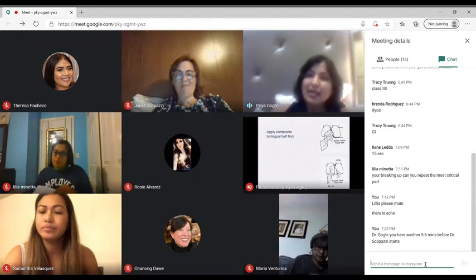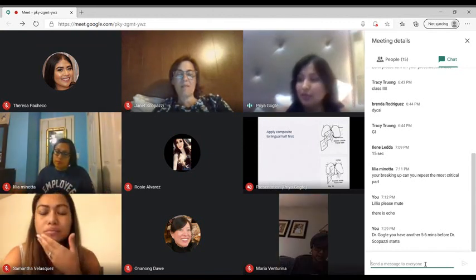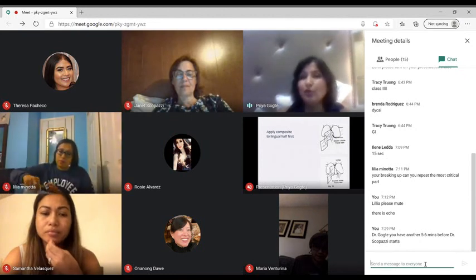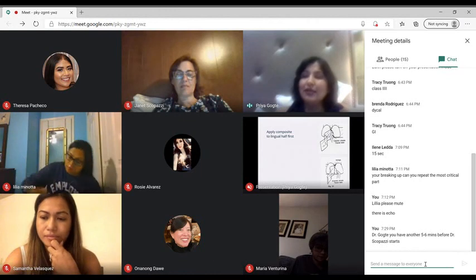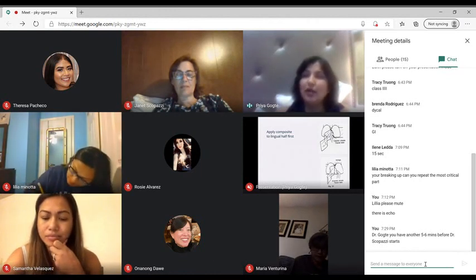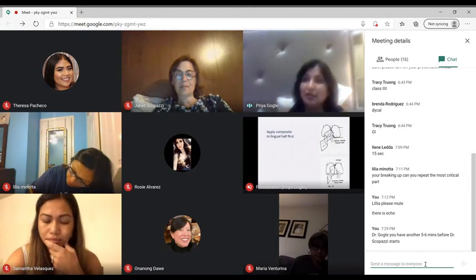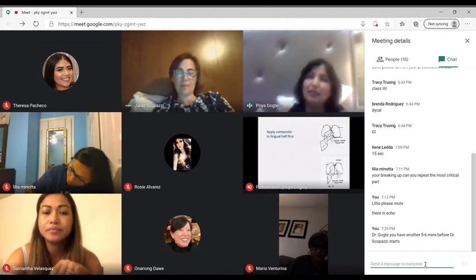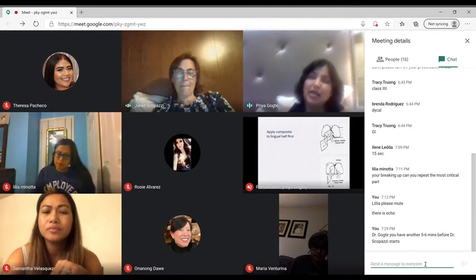And then at the incisal edge, if you want, you can put the translucent shade again. Just don't put too much translucent because translucent shades start giving a little gray look. The best is that the regular dentine shades are very forgiving and they're opaque, so they work pretty well. If you are in doubt, just use that.